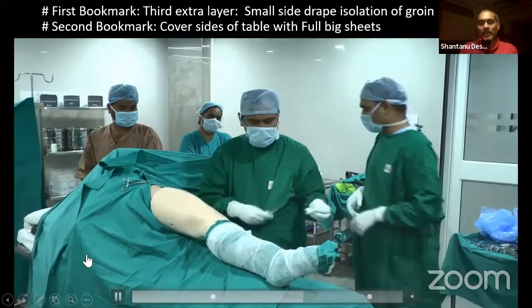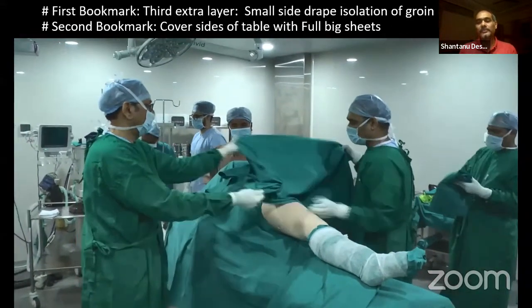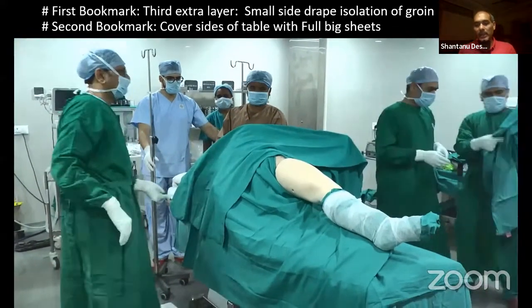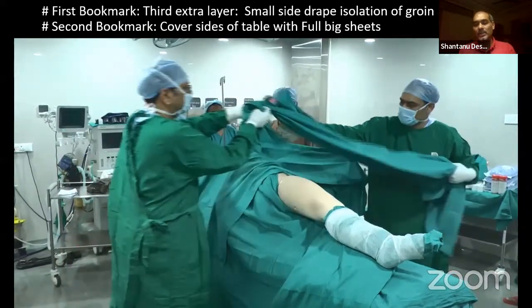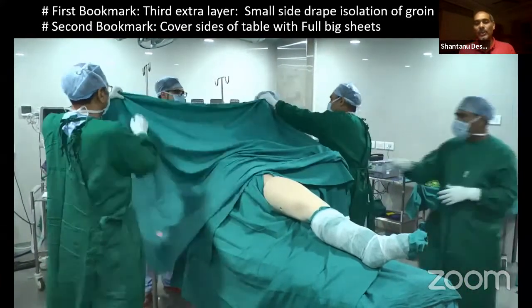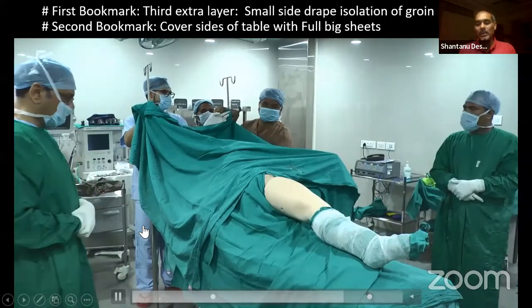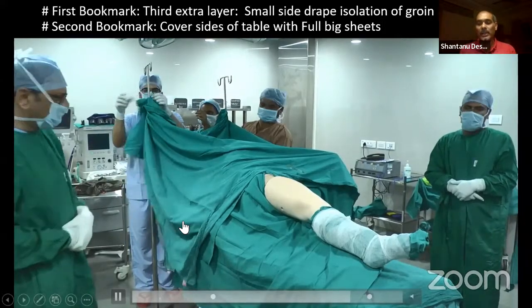the leg can be left onto the trolley or the surgical table. Now this is a proximal drape which is going to cover the body. The ends of this drape can be used as a curtain, but because this is the second drape on the proximal side, we would advise a third drape that is going towards the anesthesiologist, making sure the side ends of the arm or support, the hip support, the pelvic support, are also covered in this.